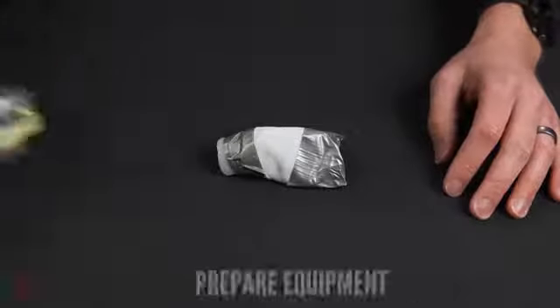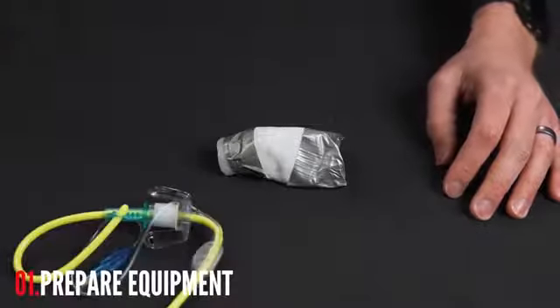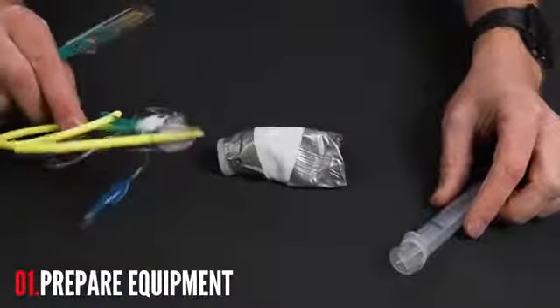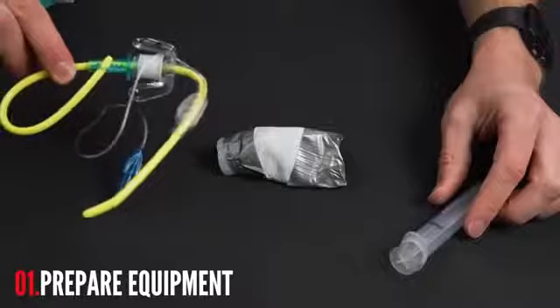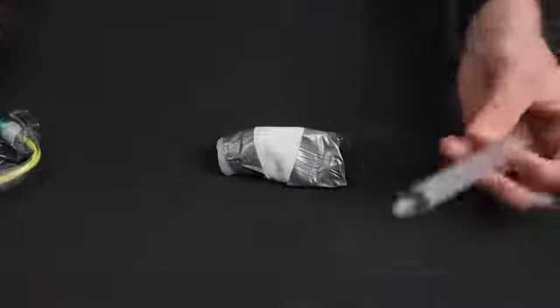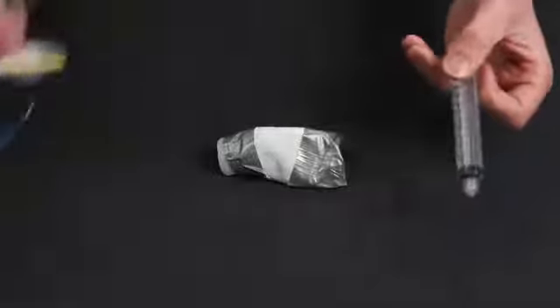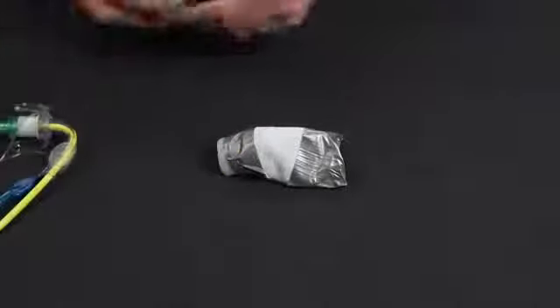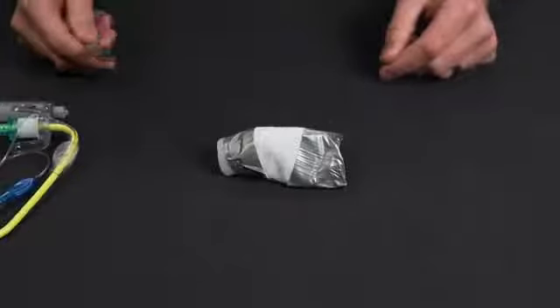So for this guy here, it's the same tools we were talking about earlier. I have the bougie preloaded in this. I think that makes it a lot easier. I don't have to feed the tube, have a partner to do it. So we're just going to have this off to the side ready to go. We've got the syringe and then we've already tested the lumen on this to make sure it will actually hold when we put it in place.